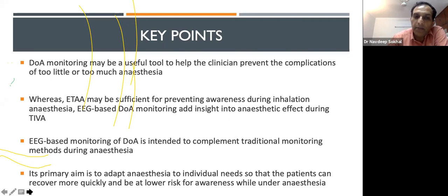Its primary aim is to adapt anesthesia to the individual's need, so that the patient can recover more quickly and be at lower risk of awareness while under anesthesia. As I said, every patient is a different patient. These monitors have been developed on volunteers, 1500 volunteers or some few volunteers, but that is not representative of the whole population. So every patient can behave differently.